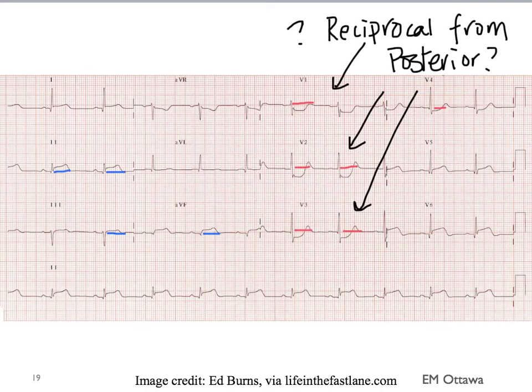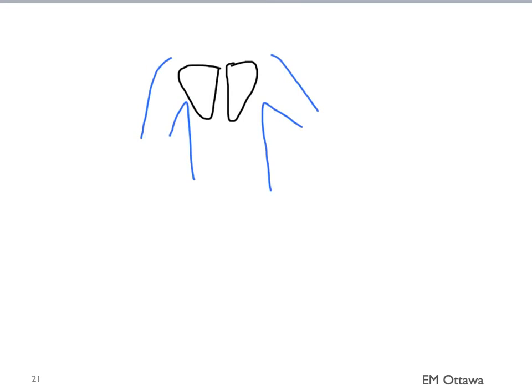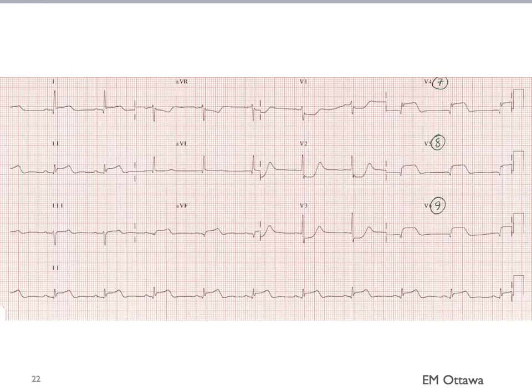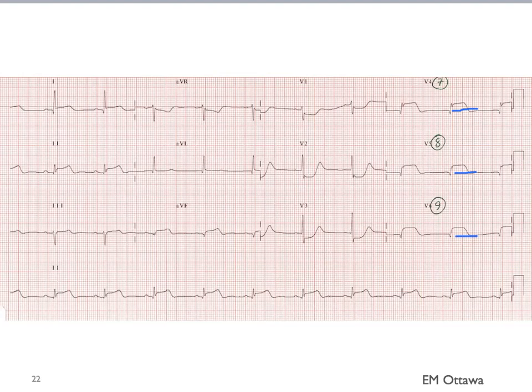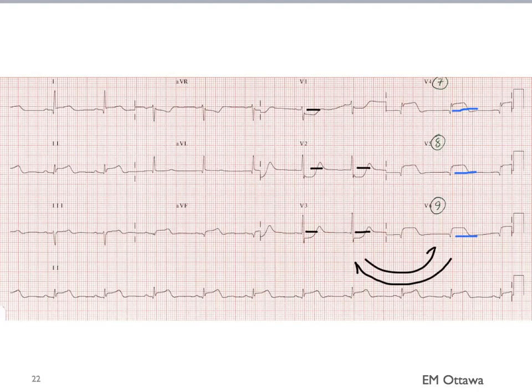To do posterior leads, EKG leads are placed on the back part of the body, just underneath the scapula. They are usually denoted by V7, V8, and V9. Often in a 15-lead, only V8 and V9 are performed. This is what the patient with ST depression in V1 to V4 looks like with V7, V8, and V9. You see ST elevation in V7 to V9 — the posterior part of the heart — and that corresponds exactly to the ST depressions in V1 to V4. The anterior and posterior parts of the heart reciprocate. Therefore, the patient is having an acute inferior-posterior ST elevation MI, and we wouldn't have picked that up had we not done the 15-lead.